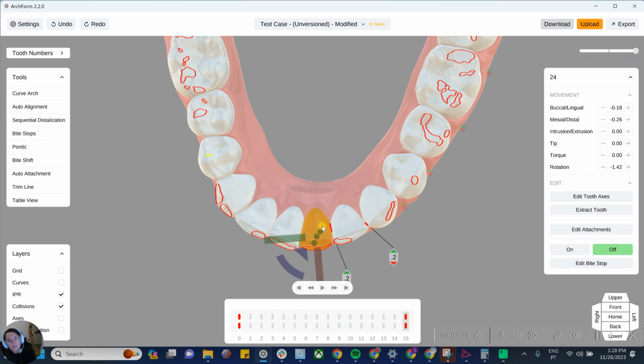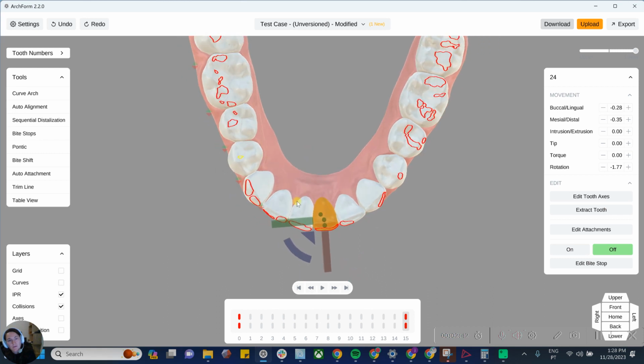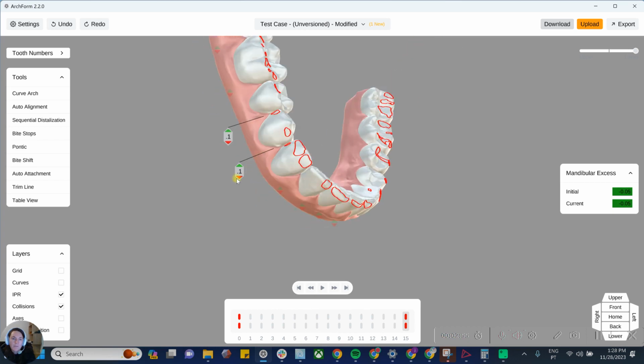After our very initial alignments, which I normally, as I mentioned, do very quick from occlusal just to get an idea about the space that we have available and just be able to assess if we're doing too much buccal movements, too much expansion, proclination, something we can just assess from here.